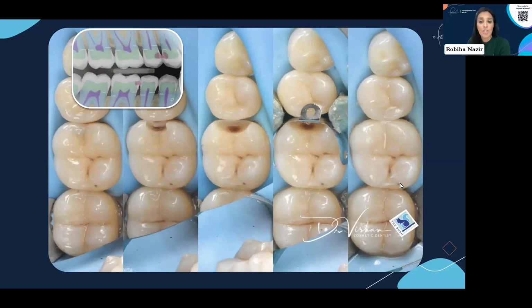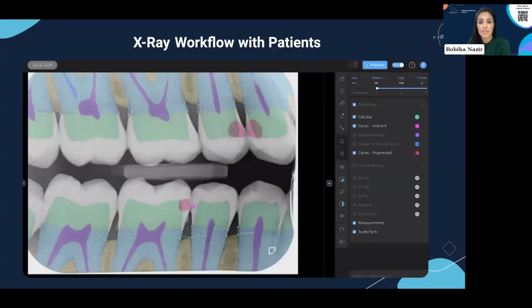Okay. Well, we've had another question. How do you access the compare mode? So I know you had a slide to show where it was. Here we go. So on this X-ray, we can only see one X-ray, but you just press this A and B button. As soon as you press that, normally on a patient's X-rays, if you've seen them a year ago, you'll have another tab here which has, say, July 2023. So you can flick between them that way. Or if you press the A and B button, you can simply click on any X-ray you want side by side, and then that'll give you the compare mode.